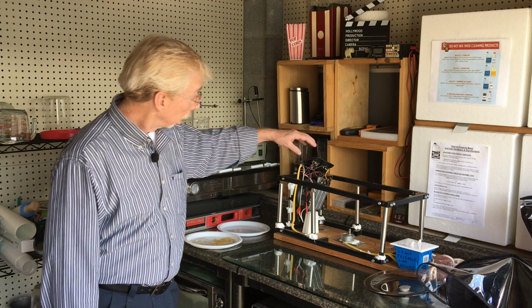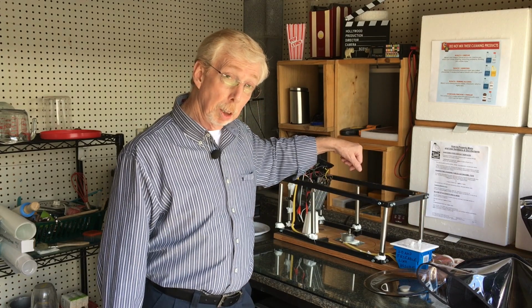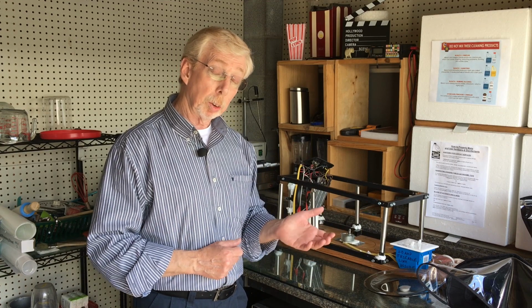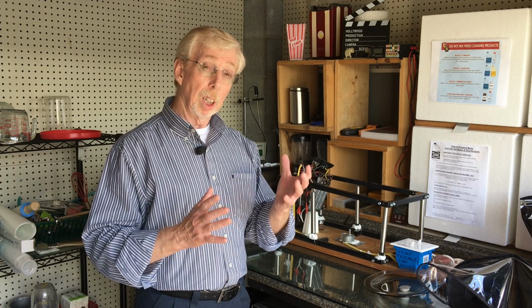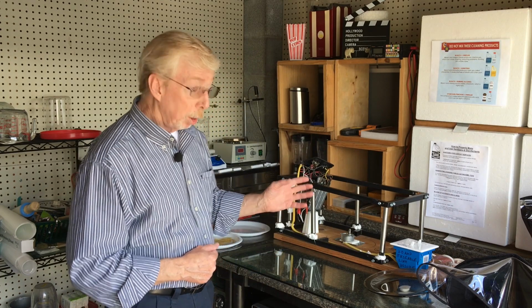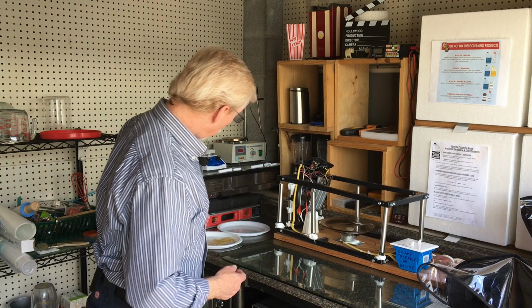Now I've got it wired to an electrical box, with switches. In this situation, this is a heater that blows across there for lamination operations, but we're not going to use that, and I'm not going to discuss that. But I will discuss that I have a separate switch to just spin the microwave motor. Because of the 2.5 revolutions per minute, over the couple of days that it's going to take for this chemistry to dry, it will allow it to be very smooth and a uniform thickness throughout. It's a very slow spinning action. So I pop that on.